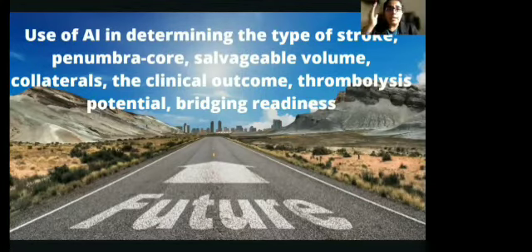When we say that, yes, the core, penumbra or the salvageable volume, collaterals, the time of onset of the stroke, and then the outcome of MRS. If there is one particular protocol or software which is giving everything to the clinician, I think that is like the holy grail for stroke medicine. So you don't need to go assessing or analyzing the information that you have.